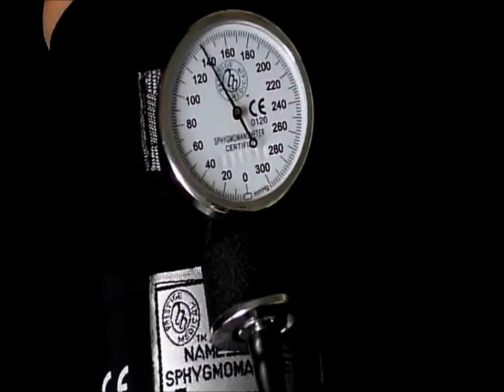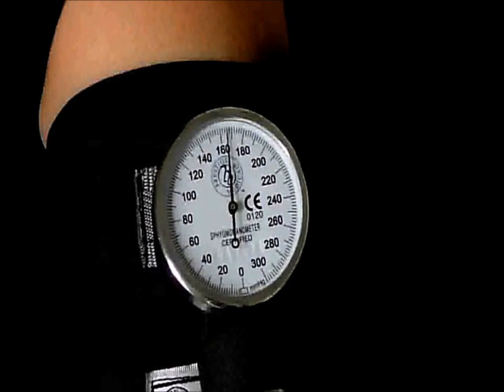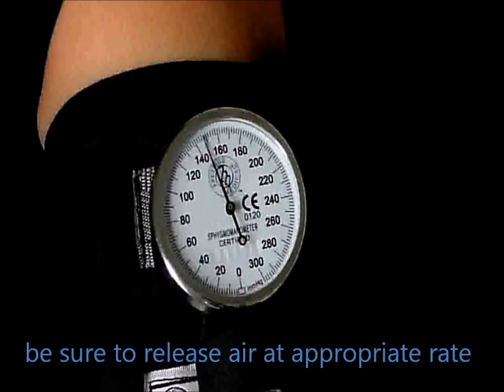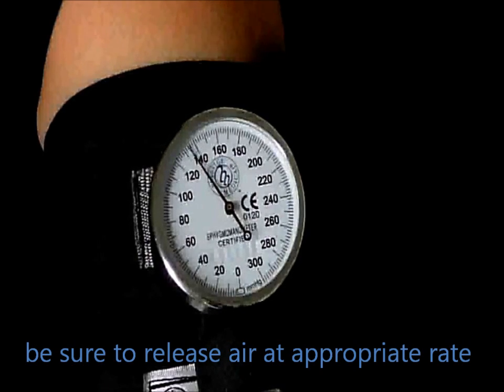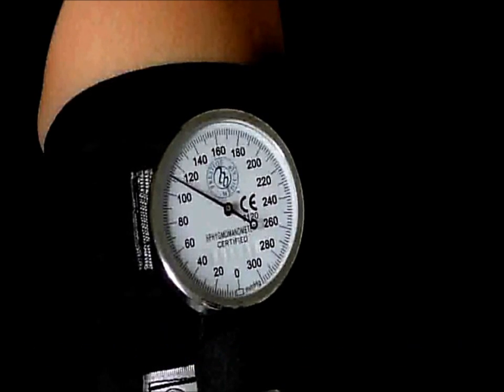As soon as you reach approximately 160, you want to begin to allow air to escape from the blood pressure cuff at a tightly controlled rate. If you allow air to escape too quickly, you will miss the blood pressure reading, but if you allow it to escape too slowly, then you will cause undue discomfort to your patient.